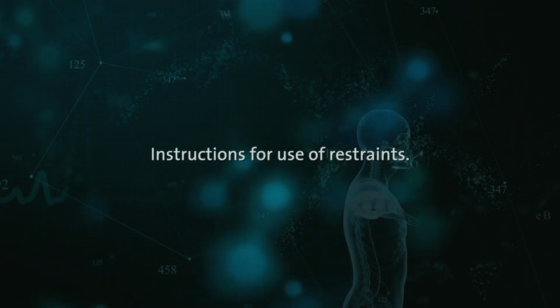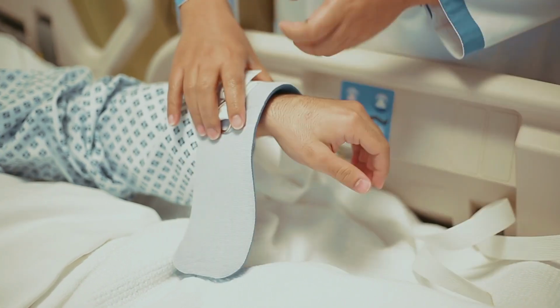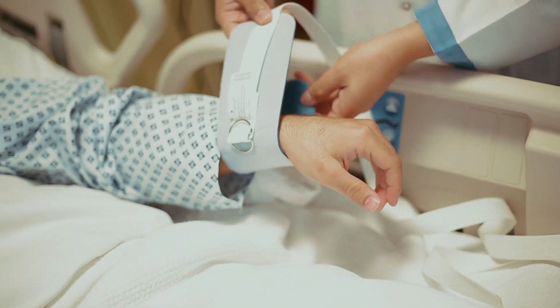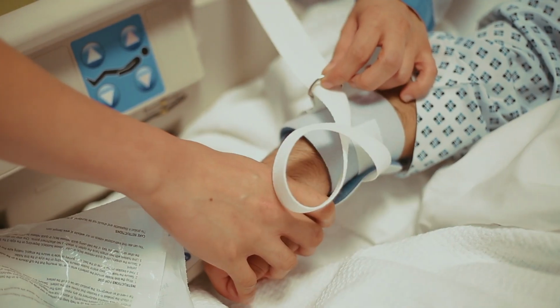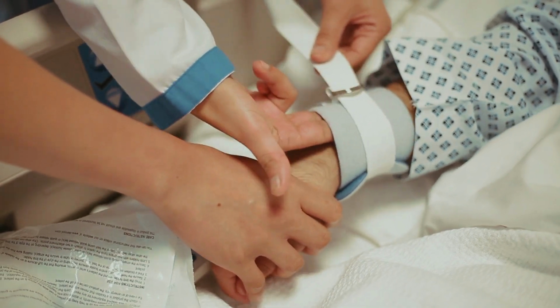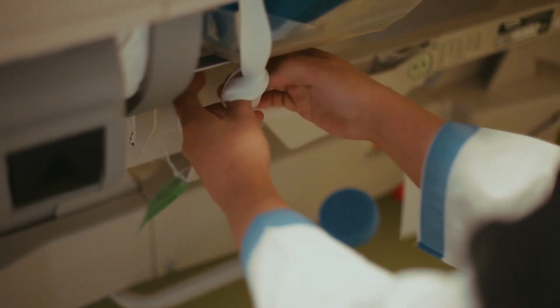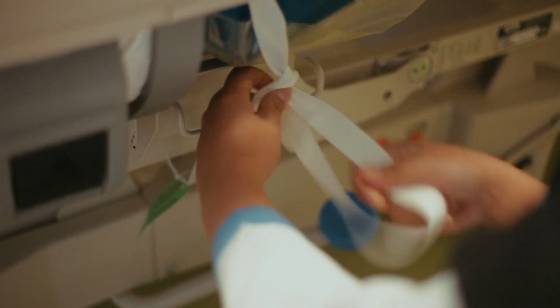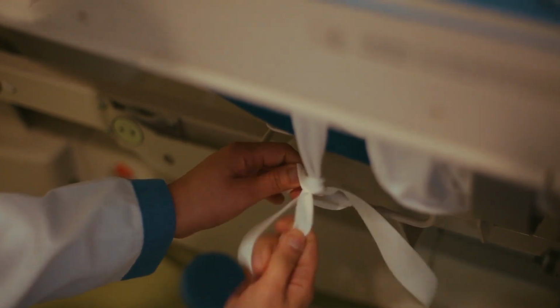Instructions for use. Wrap the limb holder around the patient's wrist or ankle, ensuring that the cuff closure is on the outside of the device. Secure the hook and loop and/or buckle closure, depending on the style of the limb holder. Find the location on the frame of the bed to secure the straps, making sure that the location moves with the patient. Secure the strap with quick release ties or quick release buckles, depending on the style of the limb holder.